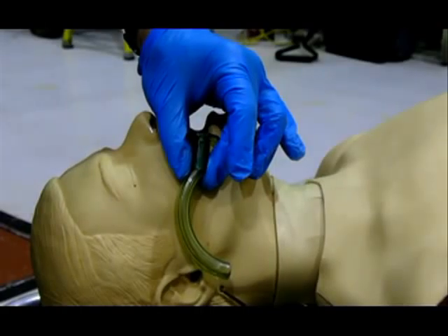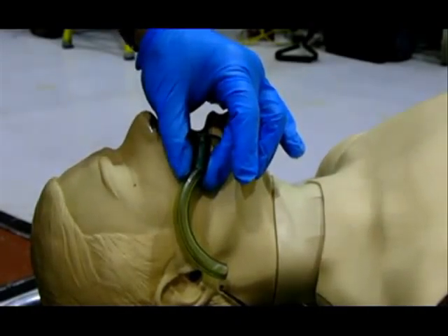If the OPA is too small, it will not hold the tongue forward and may possibly push the tongue farther back into the airway. If it is too long, it may block the glottic opening or cause trauma to the airway.